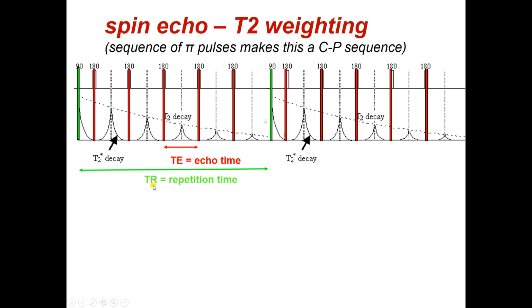So now you can see in that multiple choice question which started the lecture why TR has to be bigger than TE. All right, you can see this from this picture. There's no way that TR can be less than TE. Usually there are multiple echo times within every repetition time, like that. All right, that has to be true. So these things are both set by you.